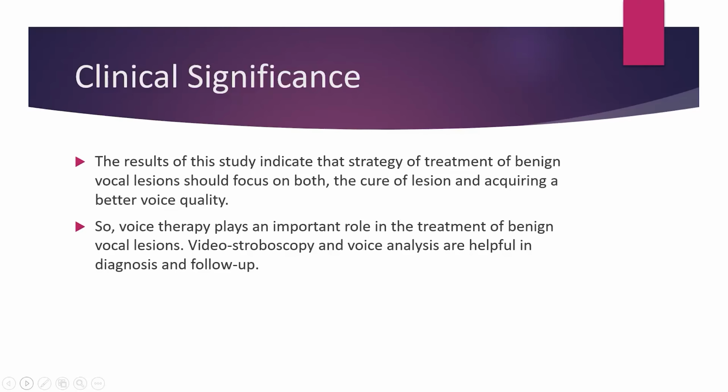So the clinical significance of our study indicates that the strategy of treatment of benign lesions should focus on both the cure of the lesion and acquiring a better voice quality. Voice therapy plays an important role in the treatment of benign vocal fold lesions. Video stroboscopy and voice analysis are helpful in diagnosis and follow-up.